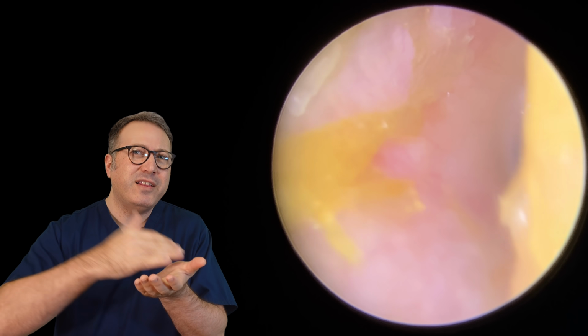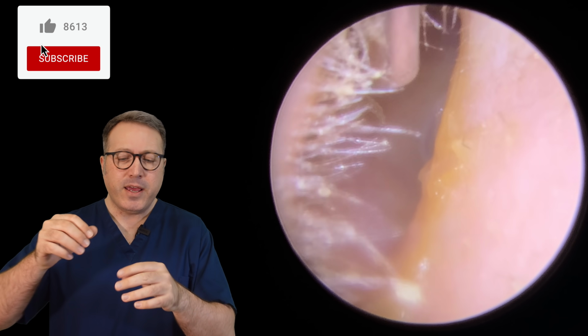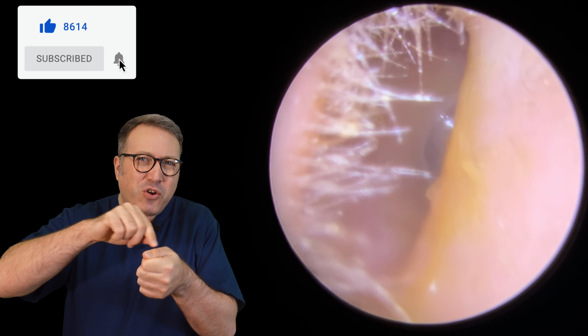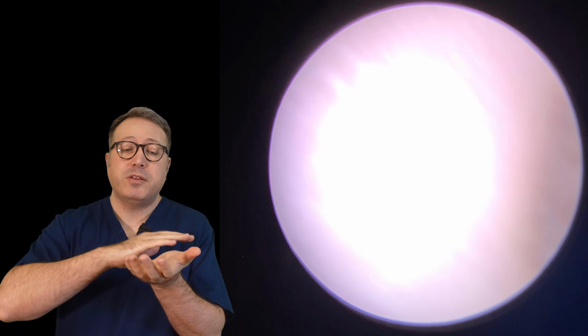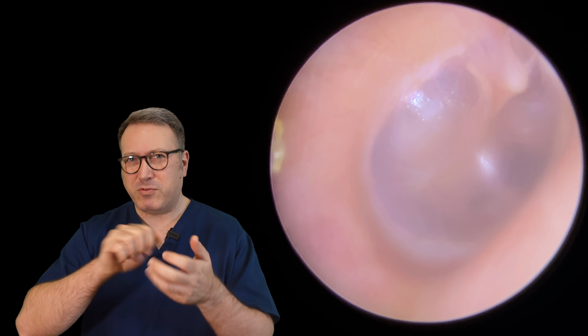So what we're going to do is rather than lift up, we're going to draw away from it and shear that off. The reason we didn't lift it, if you've ever had a pull of skin next to your nail and you've pulled it and it carries on and goes all the way down, it can feel quite sore. That can happen in the ear canal, but because the blood vessels are really close to the surface, it would cause a bit of bleeding. So we just pull backwards rather than lift up.